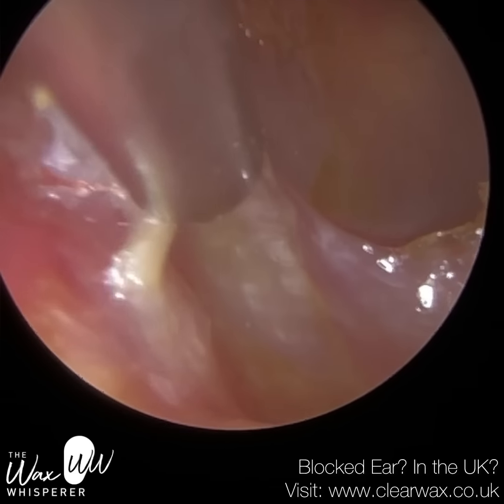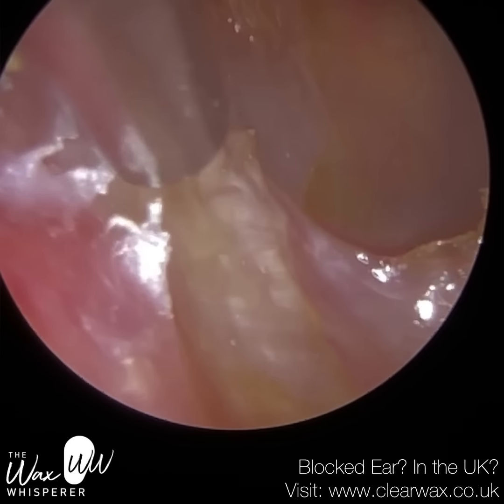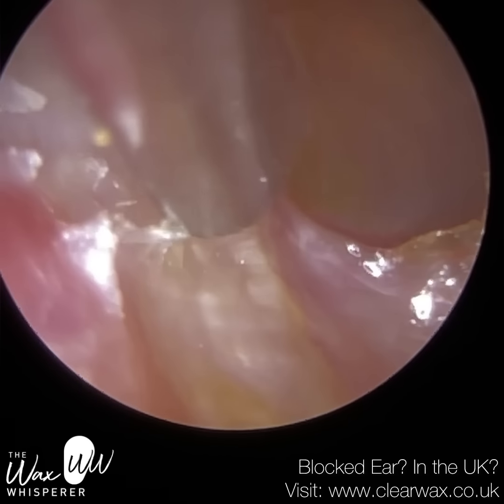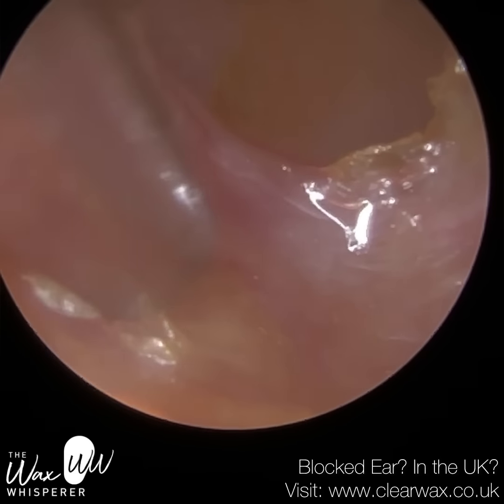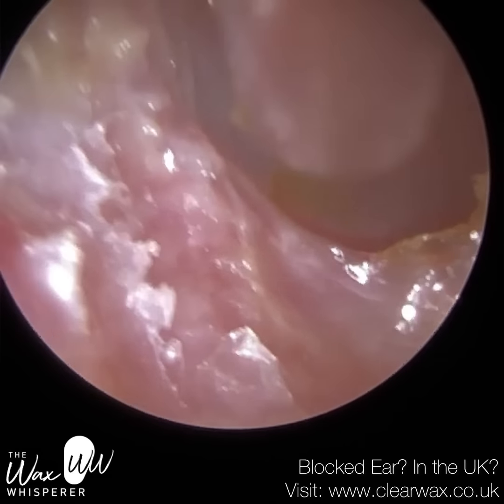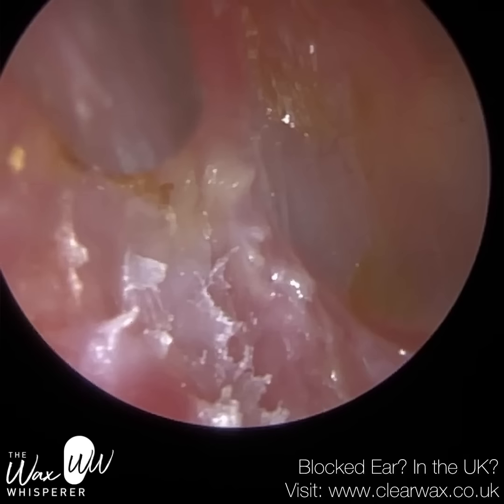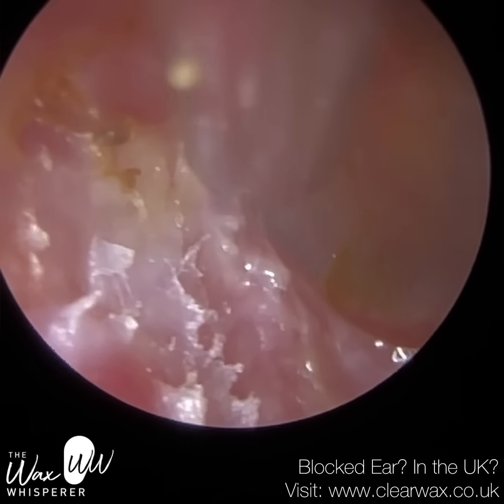So wherever possible, I appreciate it's not always possible for a specialist to do it because it might be uncomfortable for the patient, but the specialist doesn't have the optics, or they're very new to performing earwax removal, so they don't have the experience. And it is a process. I mean, when I first started, these would probably be out of my scope of practice to perform. So as you can see, there's no underlying pathology visible here. There's some crusted keratin here, so we'll just peel this away to check.